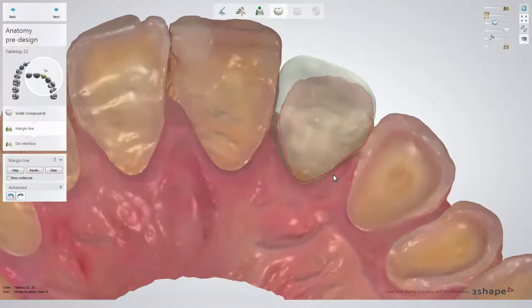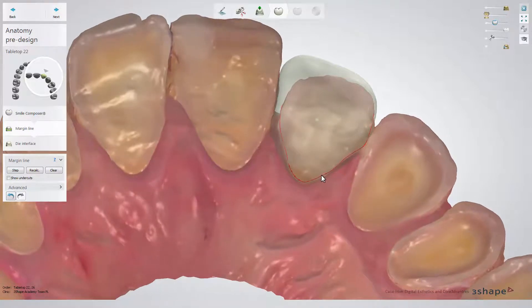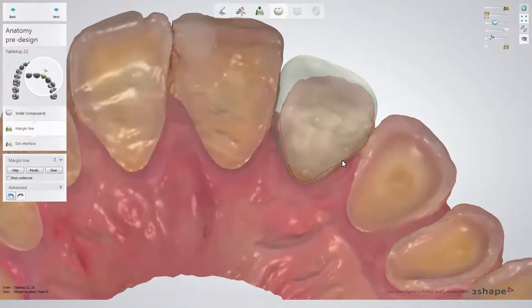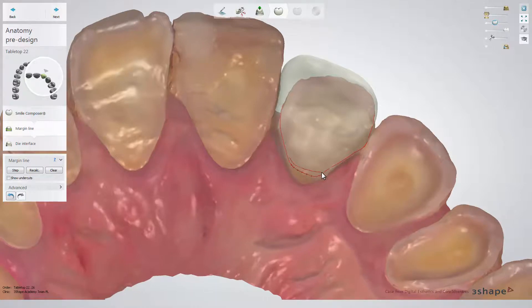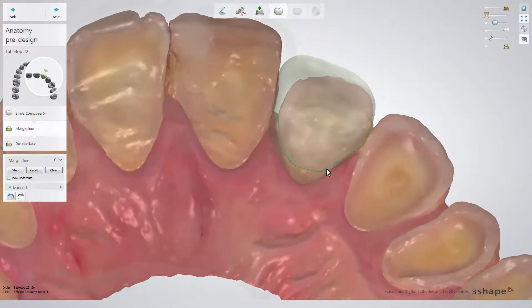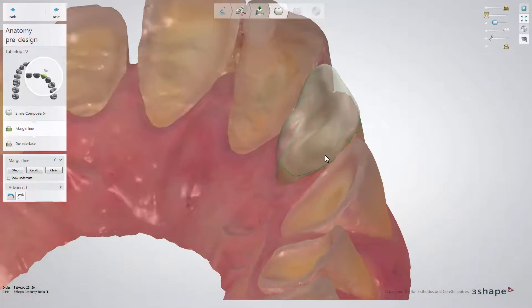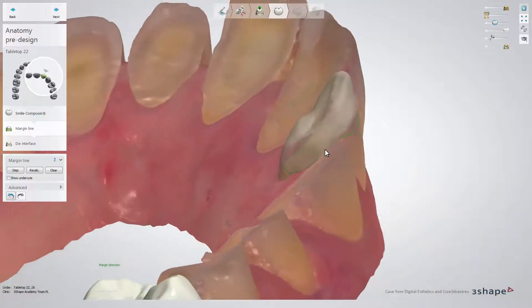When the margin line is red, it means that part of it is in the undercut area and the red dots indicate where. When the margin line is green, there are no undercuts.